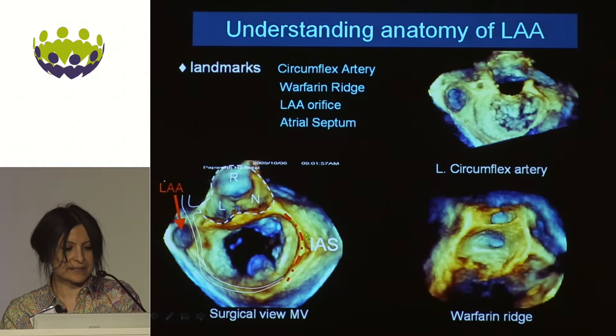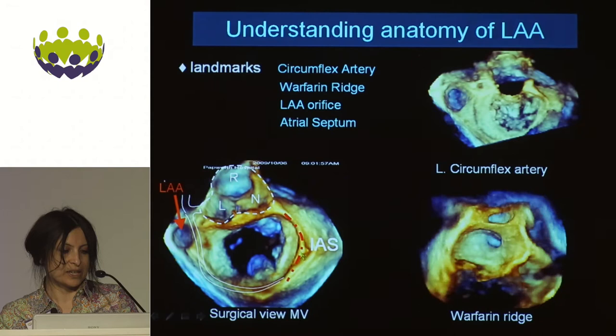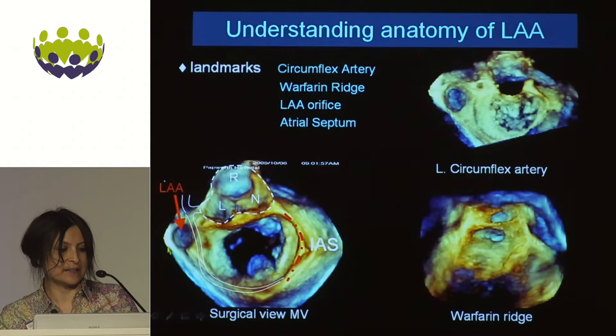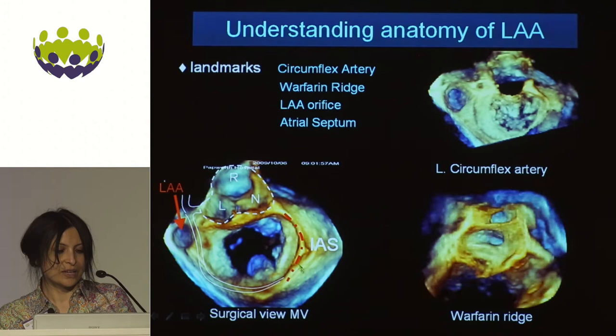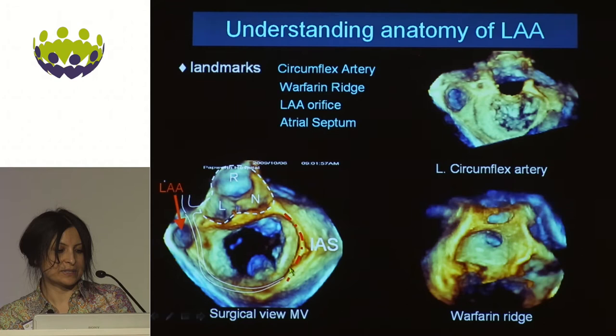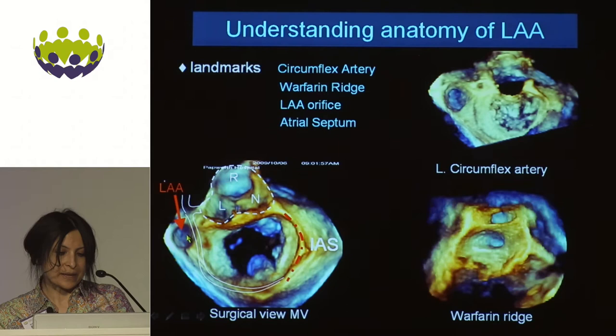The interatrial septum's relationship to the LA appendage is also key. Above will be your left pulmonary veins and the warfarin ridge. You need to ensure that you have the right angle — usually you'll find that the inferior posterior part of the fossa ovalis is the best position to place catheters to angle such that you enter the orifice correctly.